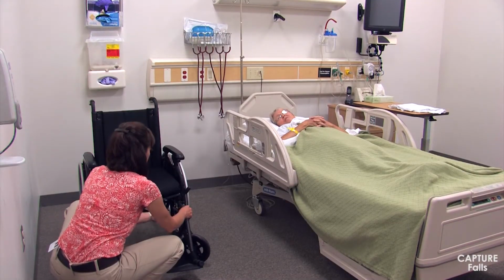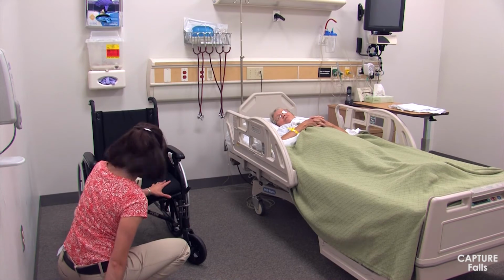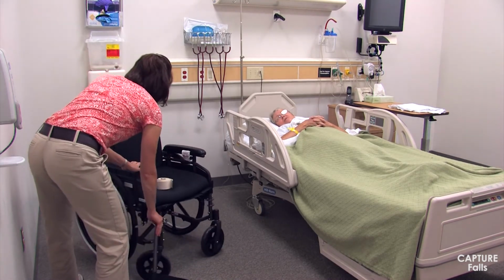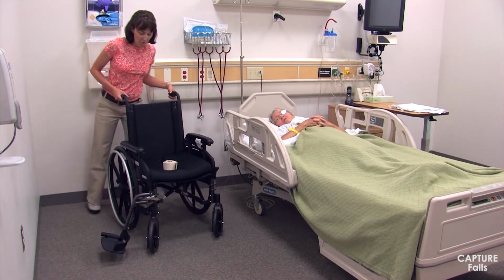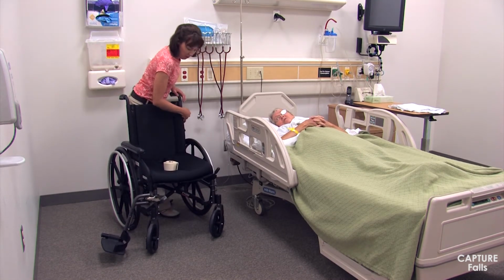The wheelchair should be positioned adjacent to the bed, but at a slight angle rather than parallel. To get the wheelchair adjacent to the bed, the leg rest closest to the bed should be removed. Positioning the wheelchair at a slight angle creates a space for the caregiver who is providing the second assist. Make sure the wheelchair brakes are locked before initiating the transfer.